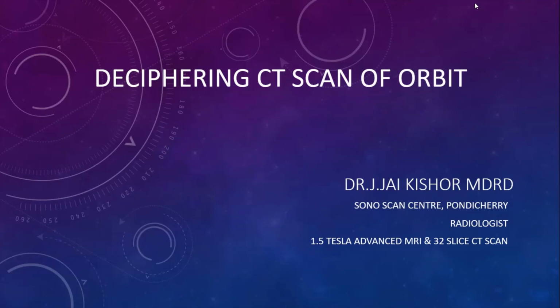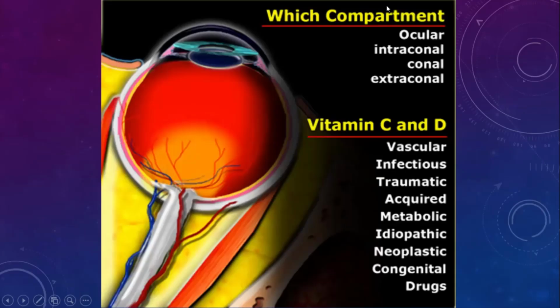Most of the cases presented here are from cases that have been referred from Arvind Hospital, mostly. And apart from this, with more than a decade of experience with cross-sectional imaging, most of the images will be shared here. Okay. So straight away we'll go into the imaging.